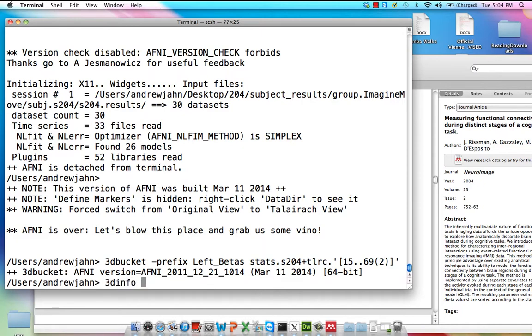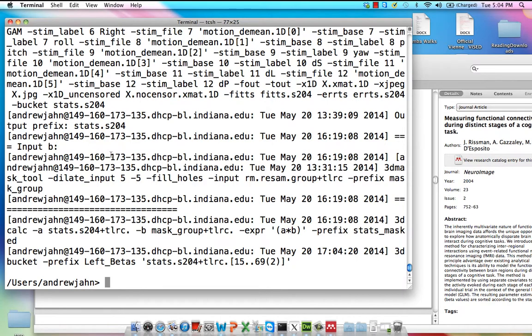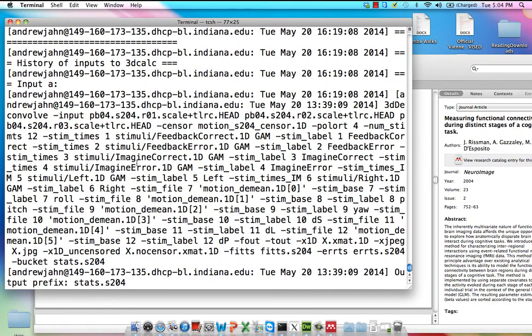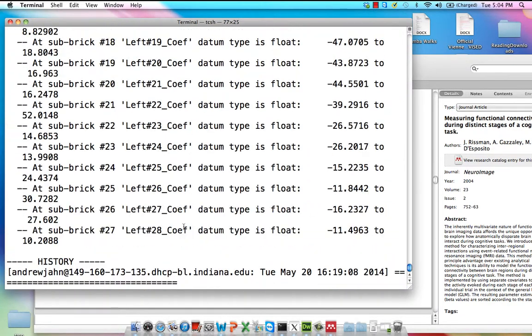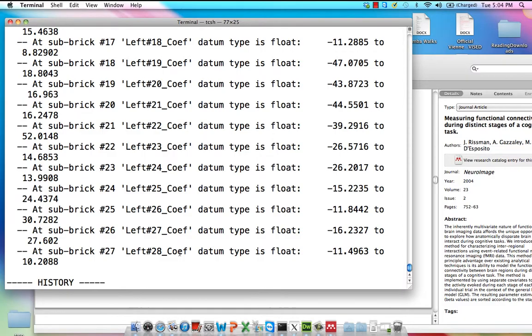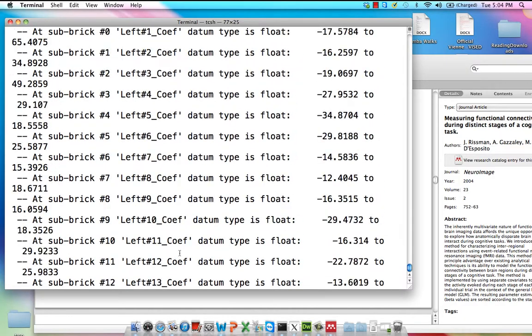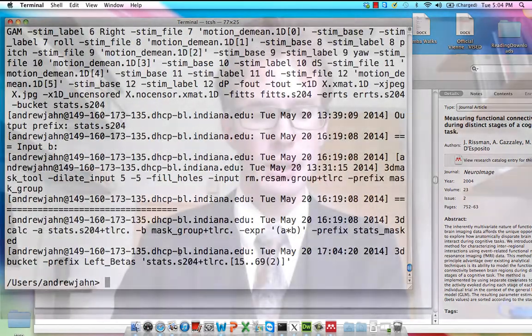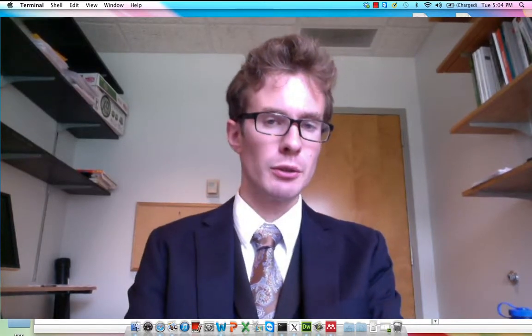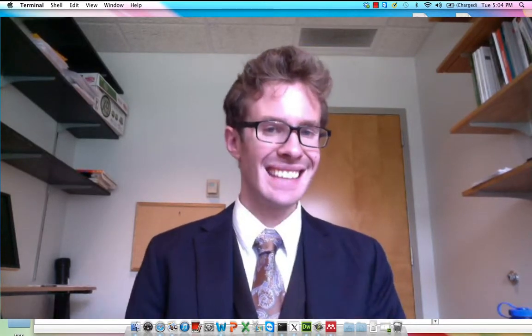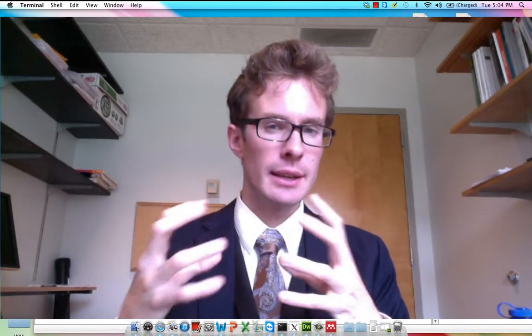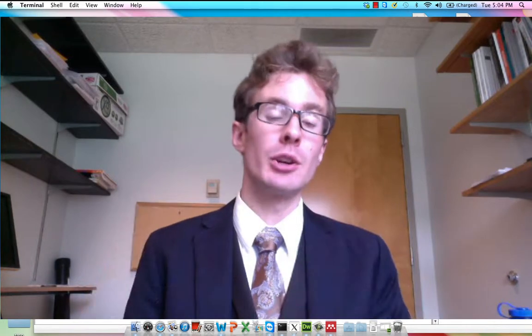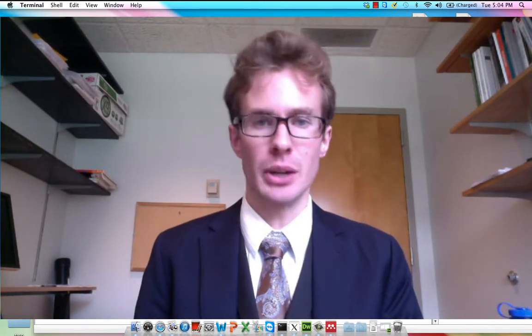Let's do a quick 3D info to make sure that it did the right thing — I'm going to make this verbose so that I get everything. Here, yes, we only have the left ones with the coefs, which are in fact the beta weights. That's what we'll be using for the next step, where we'll actually take the time course of all those betas and correlate it with every other voxel in the brain.